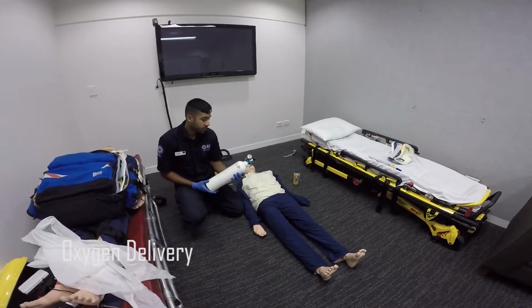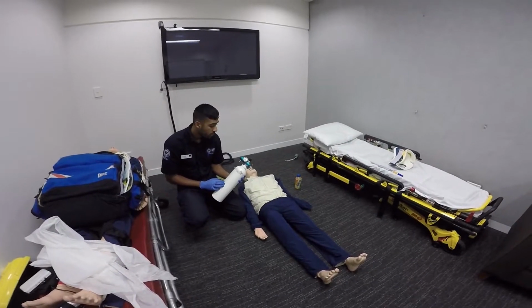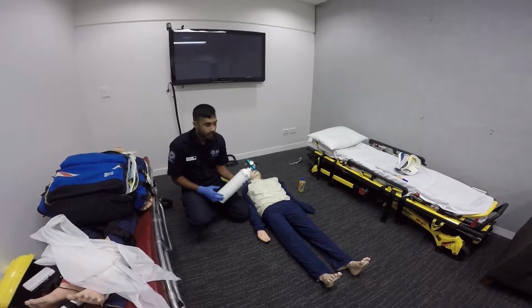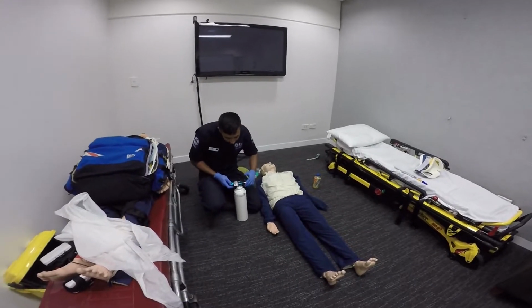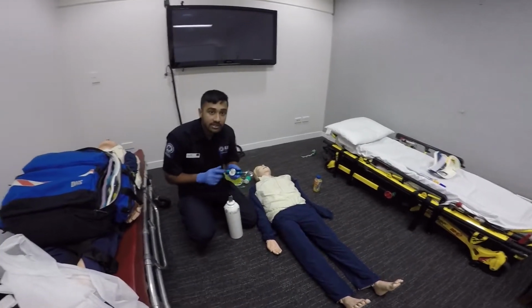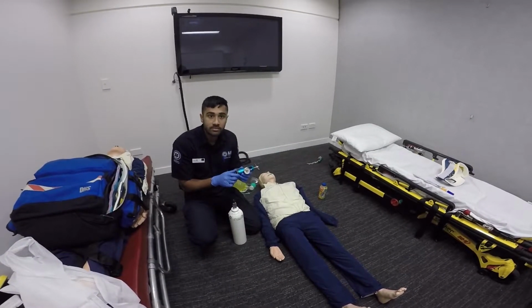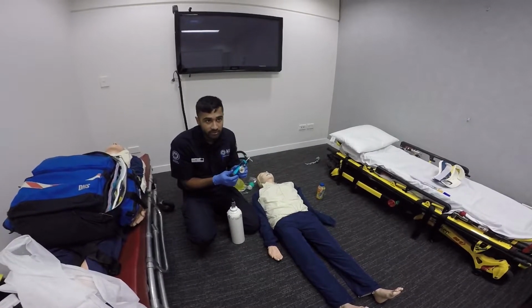This here is my oxygen administration OSCE. This is the oxygen cylinder. We know it's an oxygen cylinder because the whole cylinder is either white or black. This piece here is a regulator. It has a gauge that indicates how much oxygen is left. Over here is the flow meter. Oxygen is measured in liters per minute. This one has a maximum of 15.